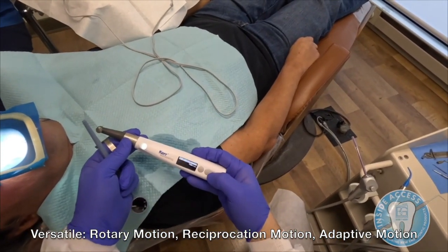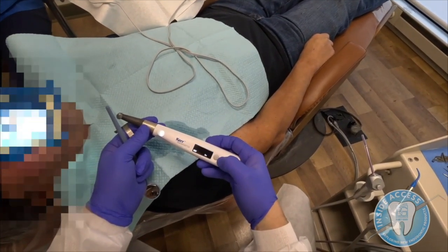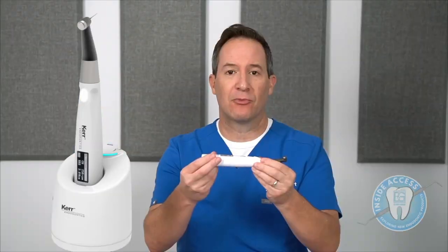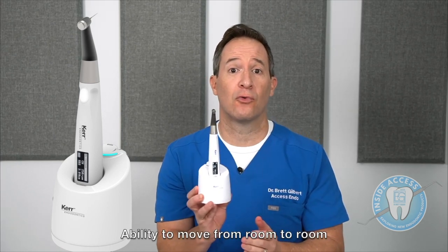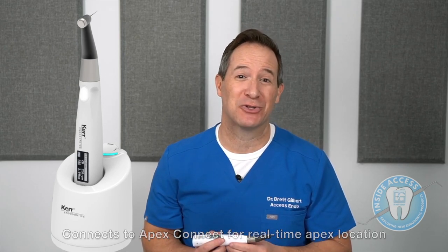What I like about it is it's very versatile. In endodontics you might prefer rotary instrumentation, reciprocation, or adaptive motion — you have the ability to utilize any of them with this cordless motor. It's very lightweight, the contra angle is autoclavable, and the rest is wiped down with Cavicide. It sits in a nice cradle and you can move it from room to room easily. And one of the coolest things is that it actually connects to the Apex Connect for real-time apex location.